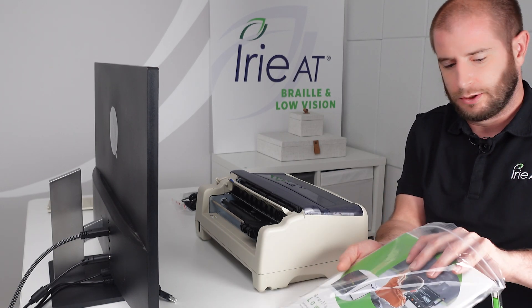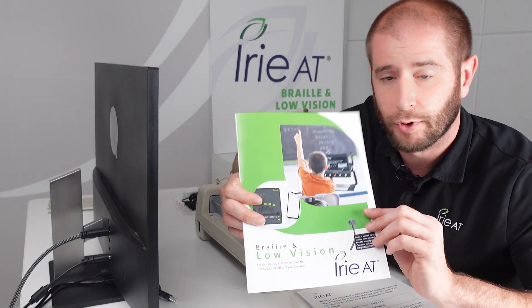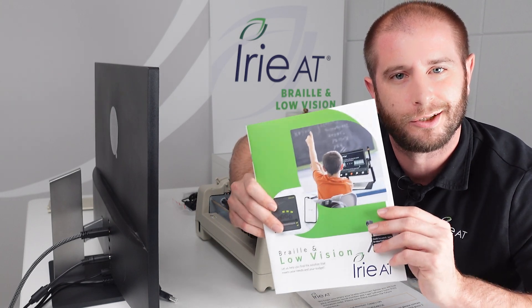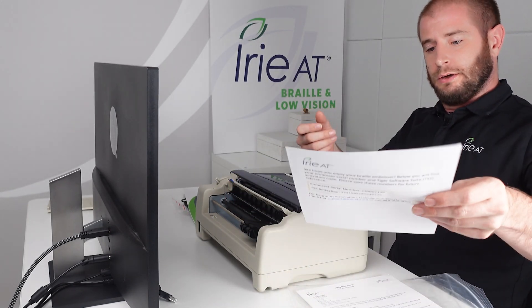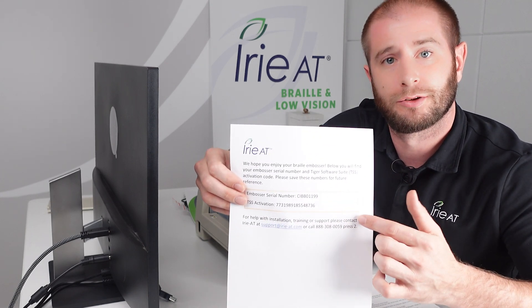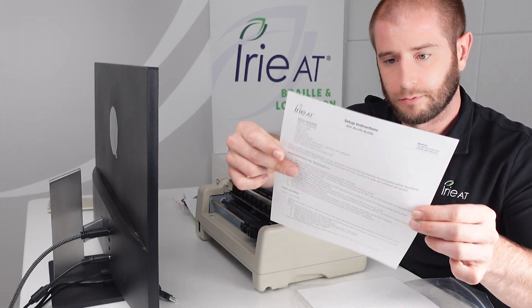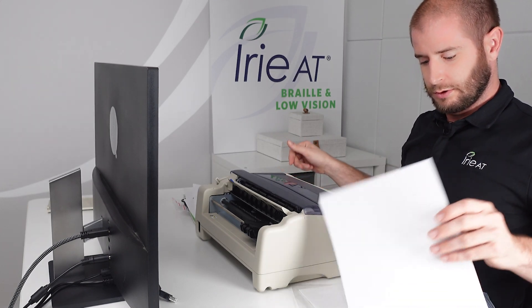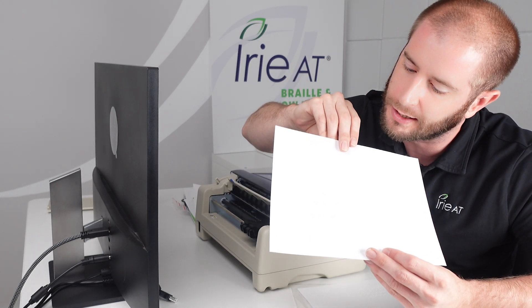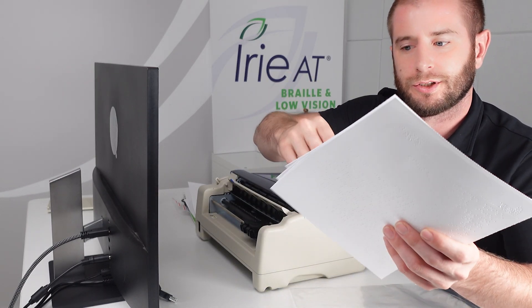Now in the bag you're going to find the Irie Braille and Low Vision hard copy catalog, featuring not only the BrailleBuddy but all of our other products as well. Since the BrailleBuddy comes with the Tiger Software Suite, you're also going to get a sheet that has the activation code as well as your embosser serial number. Following that, we have some print setup instructions, a test page — a little map of the US — just making sure everything runs properly, and your Braille setup instructions in hard copy as well.